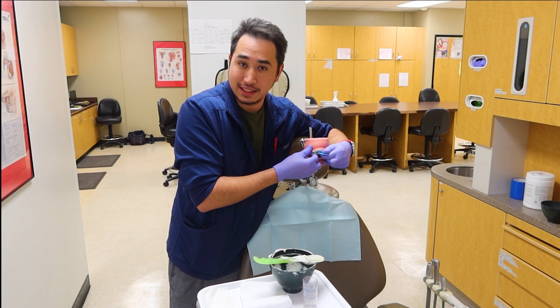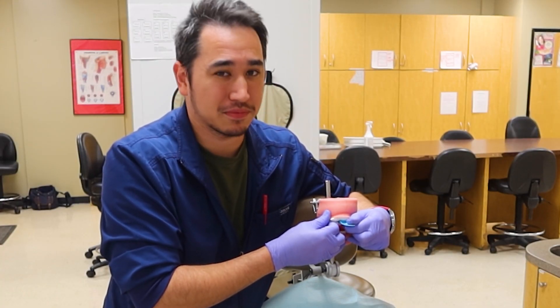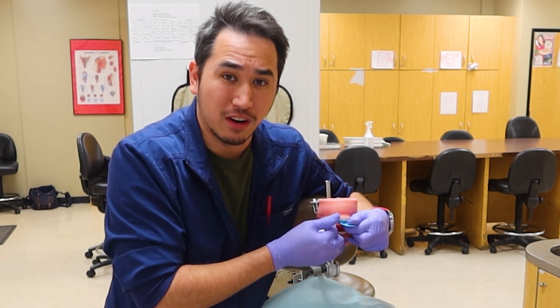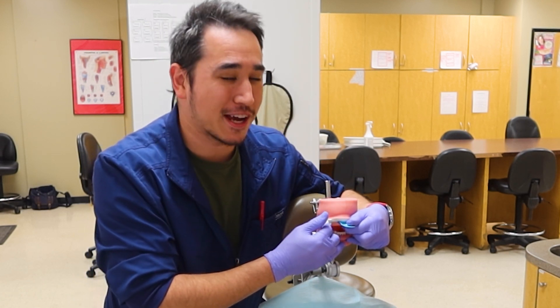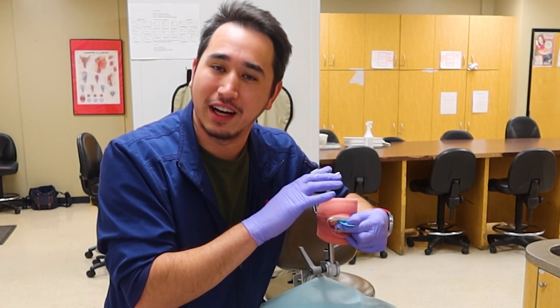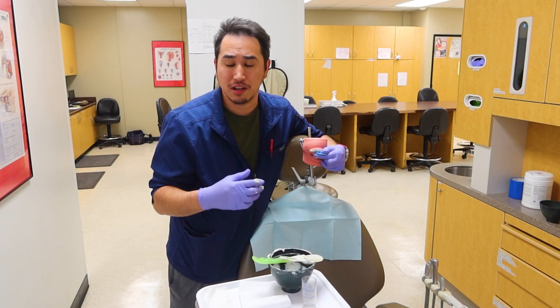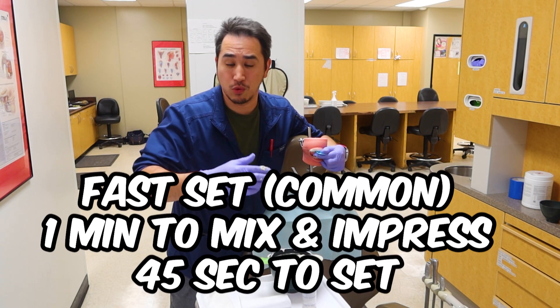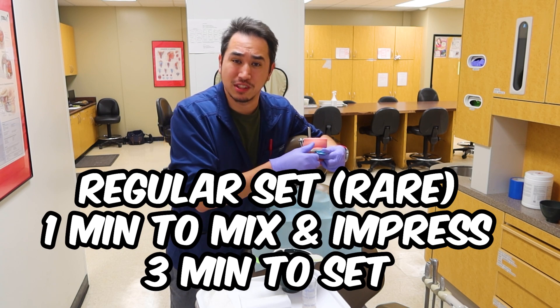Now that we have this here, sit and wait. Some assistants may put cotton rolls so the patient bites down and holds it in place, but I can't trust my patients — I'm going to hold it for them and distract them. Whisper sweet nothings in their ear, distract them, get them real creeped out. Sometimes impressions take anywhere from over 30 seconds to about a minute to set up. Some regular-set materials take about three to five minutes, which is truly unacceptable when it comes to this material — no one likes the goo all up in their mouth.